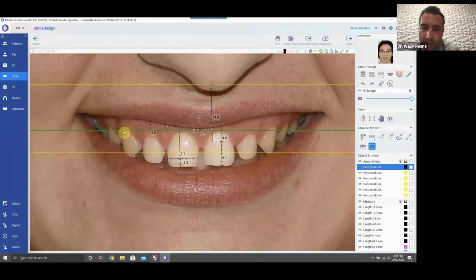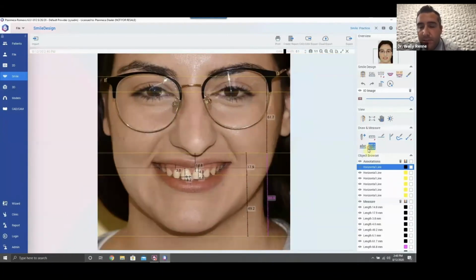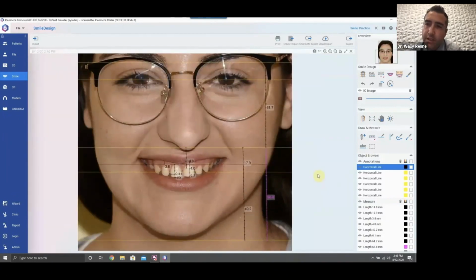And the lateral incisors should be around 1 millimeter coronal to that line, which they look like they're about. But if you notice that cuspid number 11 is apical to that line, so she has some gingival architecture asymmetries that will need to be addressed, whether surgically or orthodontically, I don't know yet. We haven't really finished analyzing her smile.